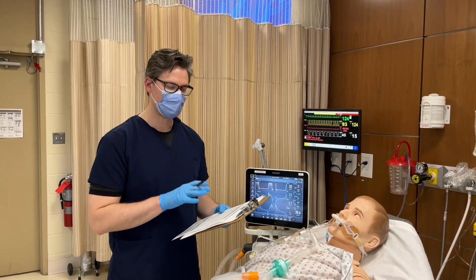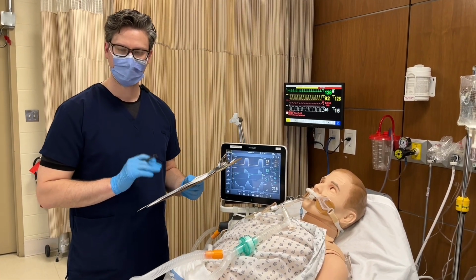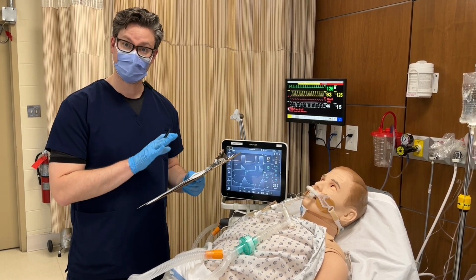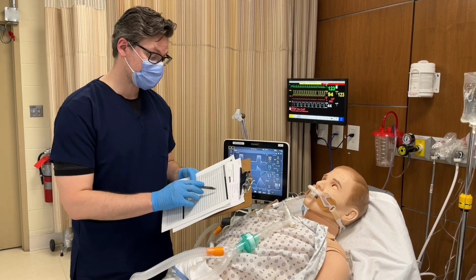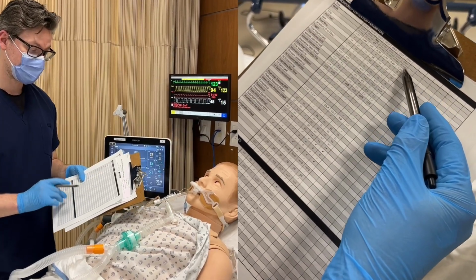Ensure to review your patient monitoring record of the mechanical ventilator. Your findings and observations during your inspection, do they match what was previously written? If there are changes, ensure you note them. When filling out your patient monitoring record, ensure to fill out every aspect of the mechanical ventilator.